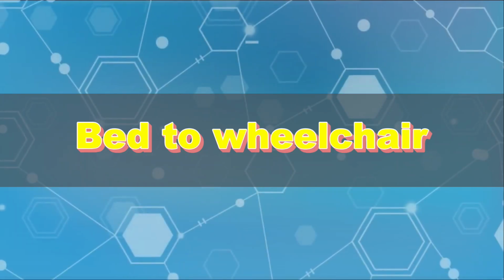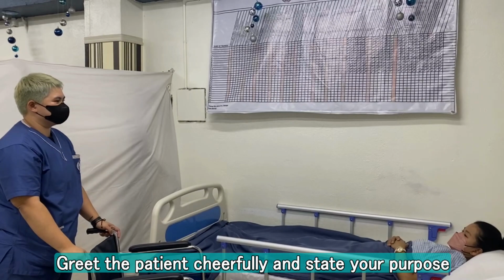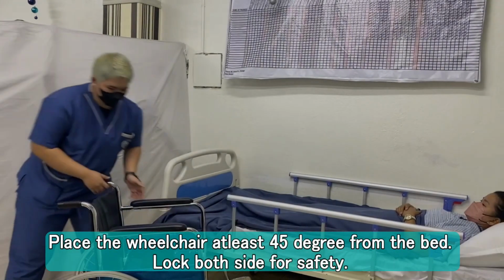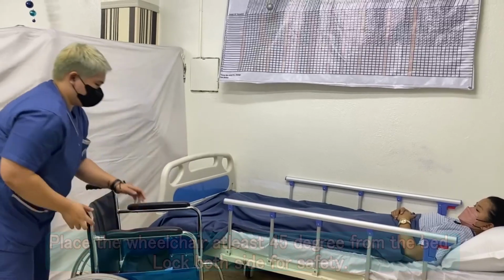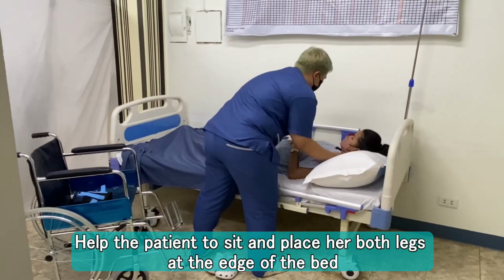Bed to wheelchair. Greet the patient cheerfully and state your purpose. Place the wheelchair at least 45 degrees from the bed. Lock both sides for safety. Help the patient to sit and place her both legs at the edge of the bed.